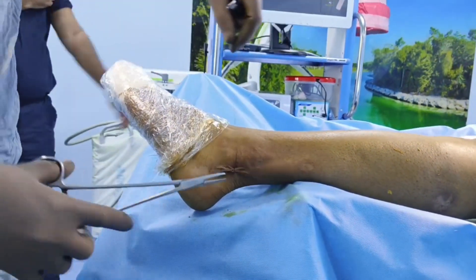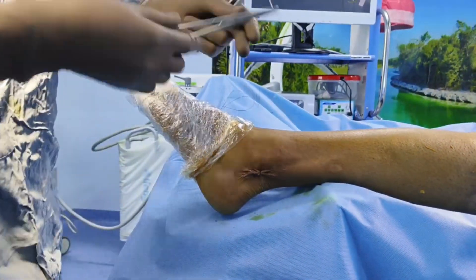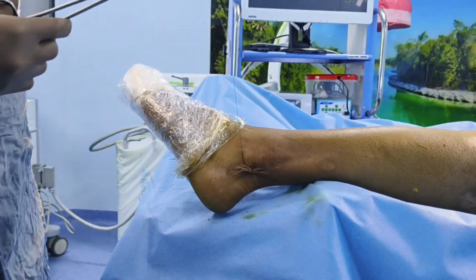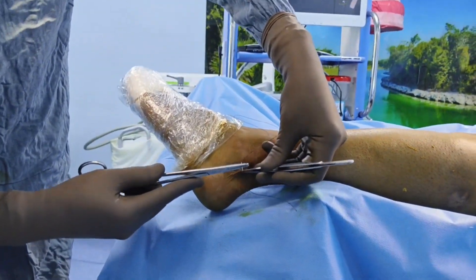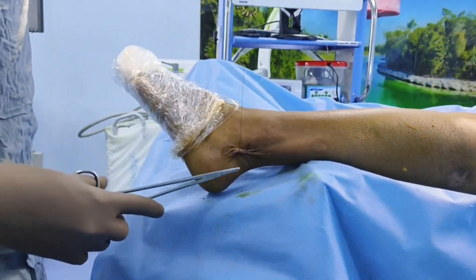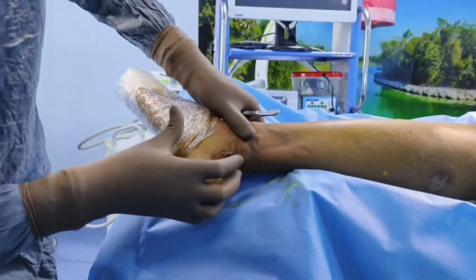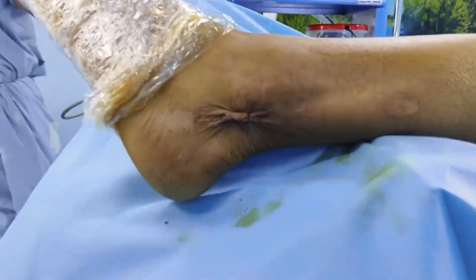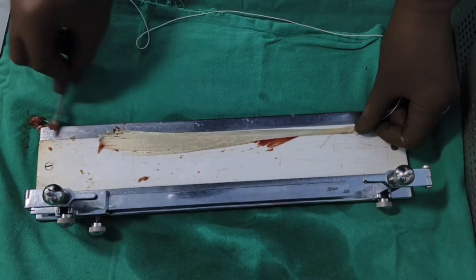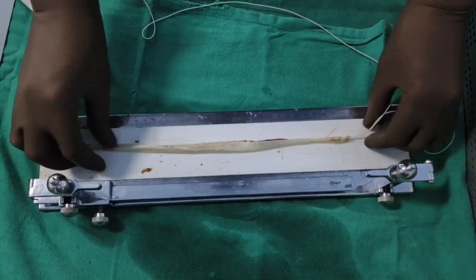Once the tendon has been harvested, the next step is to prepare it as an ACL graft — that is covered in another video in my list. The closure requires only two or three sutures maximum. This is the complete closure procedure, then you do the dressing. This is the tendon which we have just harvested; further preparation can be seen in the other video.